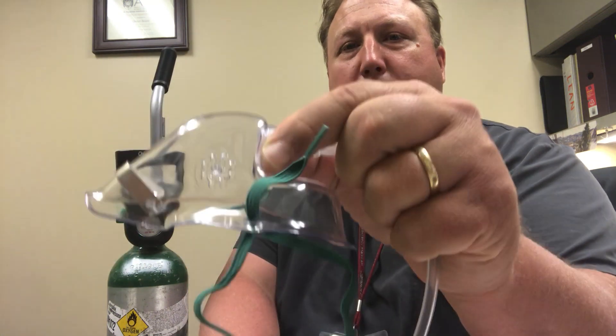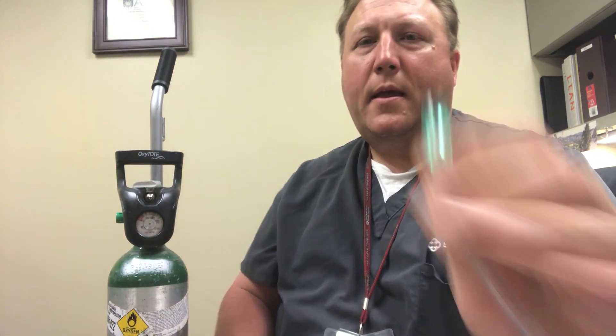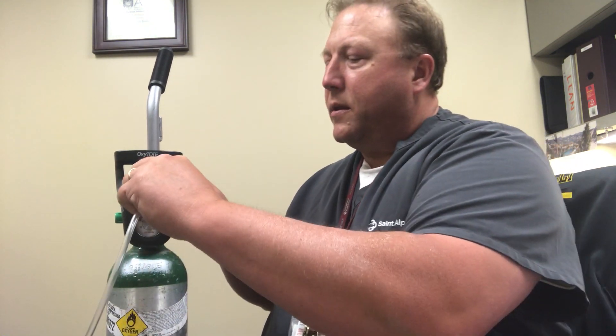The simple mask looks like this. This end goes to the patient, and this is the adapter that hooks to the oxygen cylinder. There is a nipple right here that it will attach to.